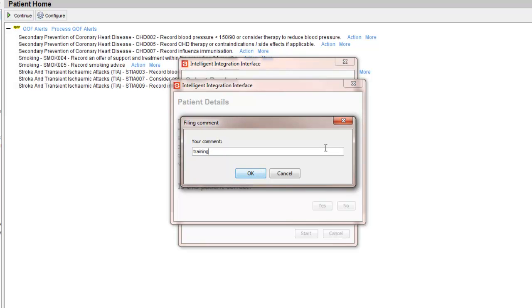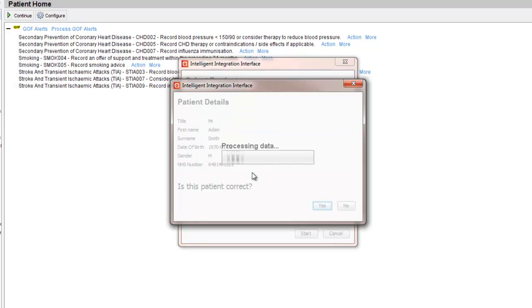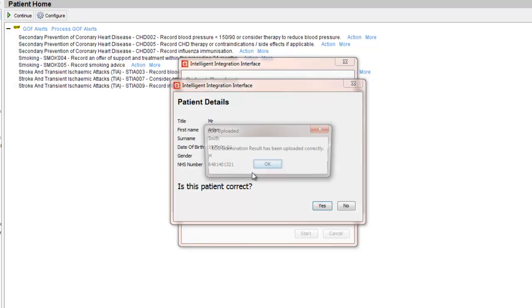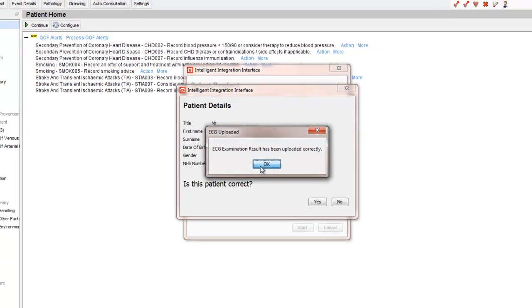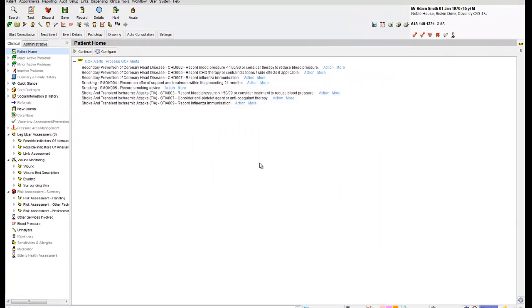If a comment is not required, simply leave the text box blank and click OK. The document is now being filed into System 1 and shortly after a confirmation of filing will be displayed. Click OK on the confirmation message and the I3 software will close.